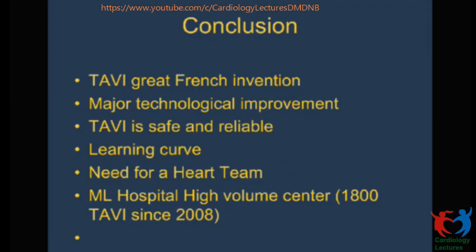Please check that your surgeon will be with you to help you if you have vascular damage or annulus rupture, okay? And I tell you this because in our institution we have done more than 1,800 procedures over more than 10 years, and I know what I mean. You cannot do the procedure without a surgeon. So please let the heart team be very good, because you will have patients that the surgeon will not want to operate on, and you will give the surgeon the patients that you think would be at high risk if you do TAVI for them.